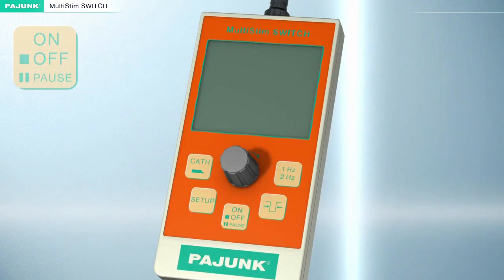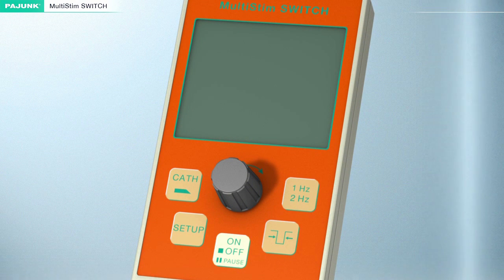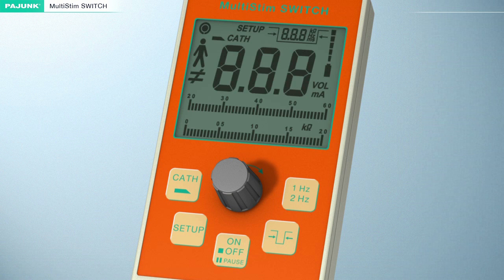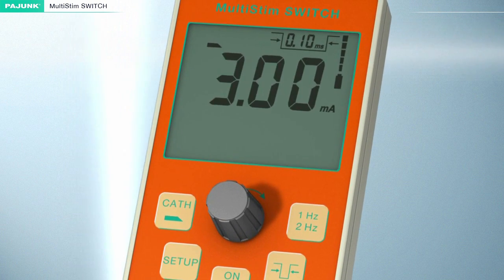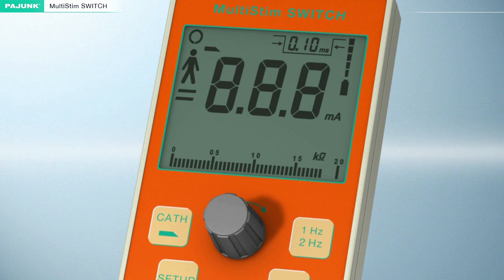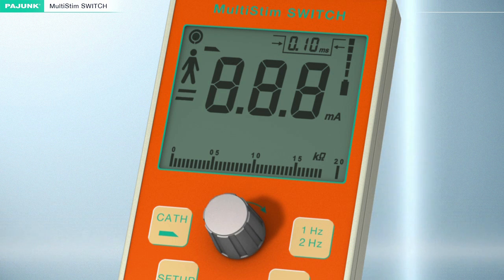On, off, pause key. Press and hold the on button to start the device. The device will then automatically initiate a self-test sequence, then switch to pause mode and the LCD display will start to flash. Depressing the turning knob will deactivate the pause function; repressing will activate it.